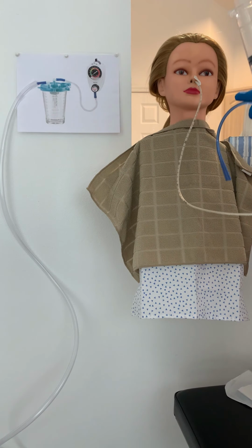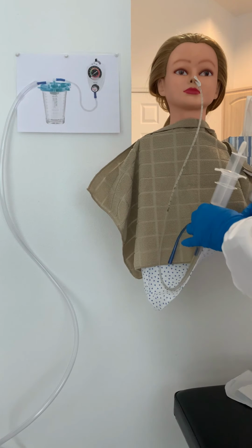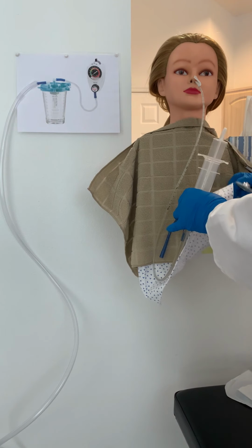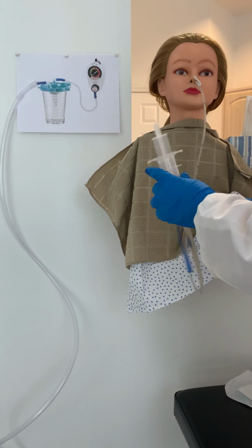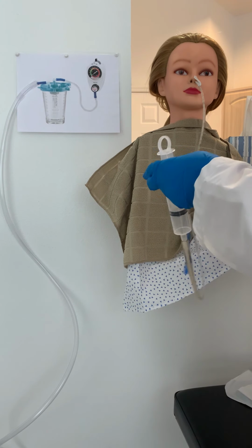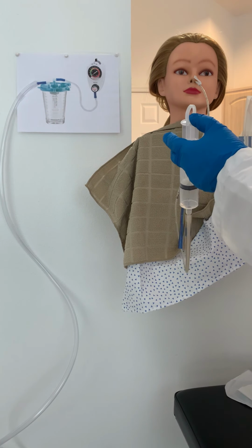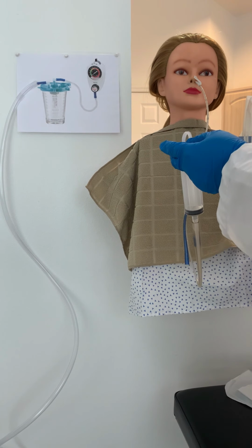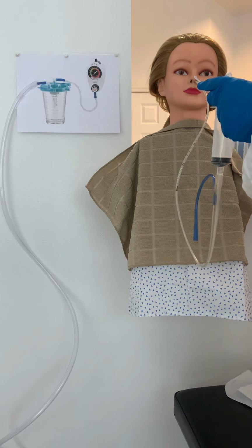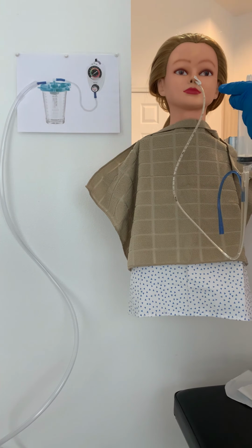Okay. I'm going to listen to the upper left quadrant of the abdomen underneath the gown. So I'm going to put that there. And then I'm going to push the air in really fast and I should be able to hear a gurgle swoosh sound. So there, I heard the sound. So that's a good sign. That's one way to tell we are possibly in the right place.